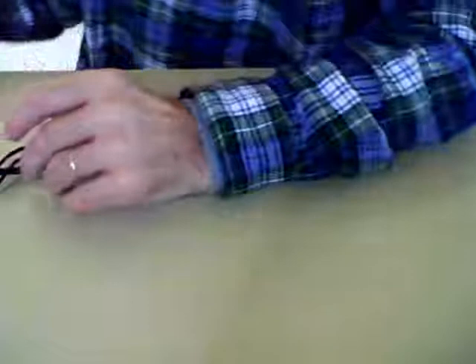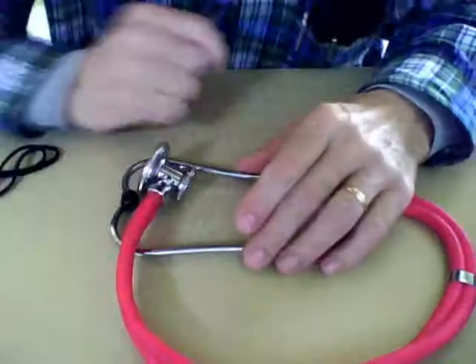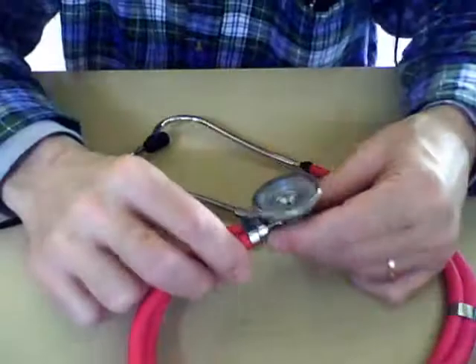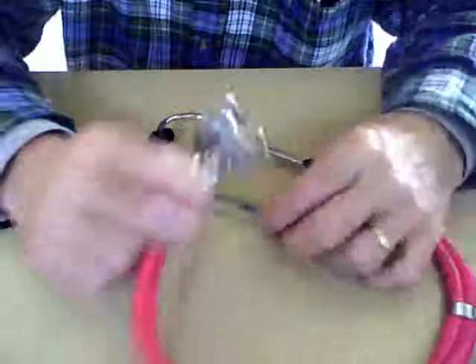Everybody has a stethoscope. We don't use this so much anymore because we've switched from the manual blood pressure cuff over to the digital. But this is nice to have. You can listen to your heartbeat and get some information that way.